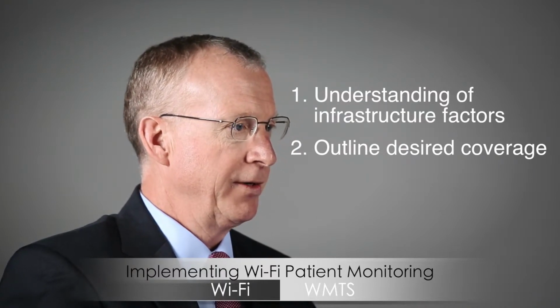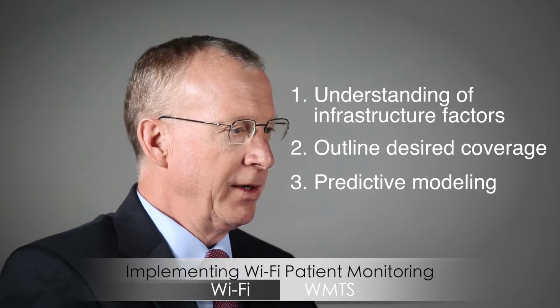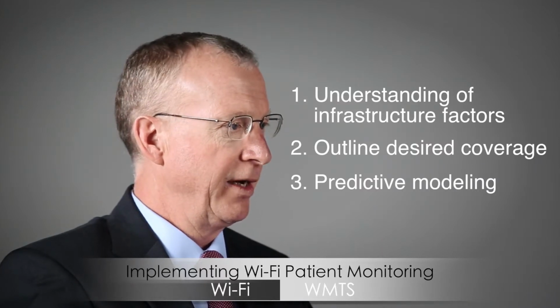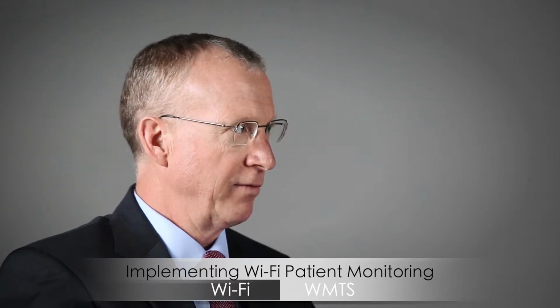Then based upon that, I would use a predictive model that could take that into account. I'd also get on the phone with the facilities and understand the age of construction of the facility, to understand the wall compositions, the tile, the types of rooms, where they'd have the bathrooms located, any isolation rooms, any lead-lined rooms in radiology. And I could take that understanding after conversations and discussions and build a predictive model of that facility.